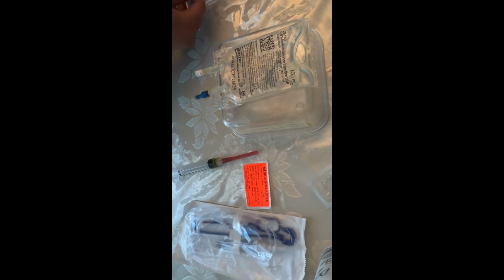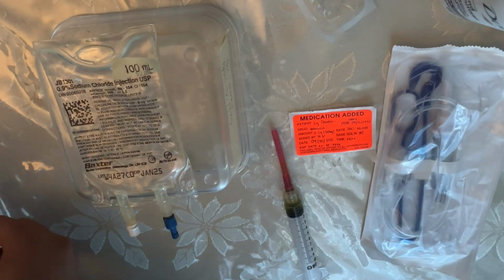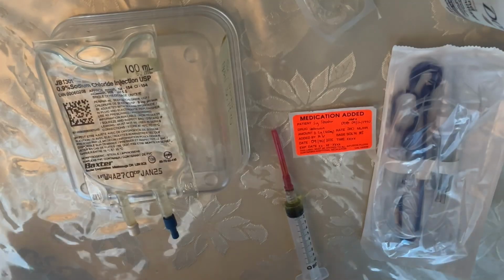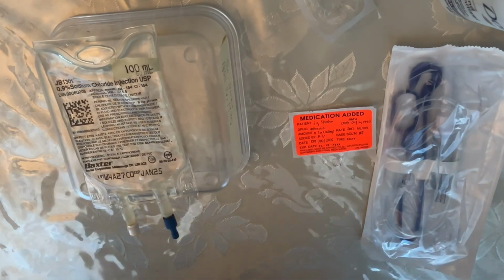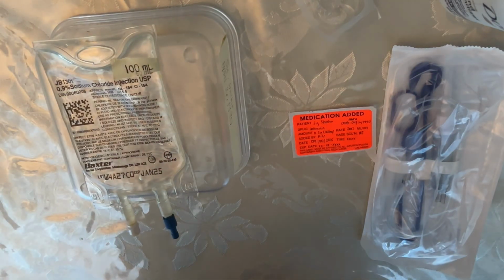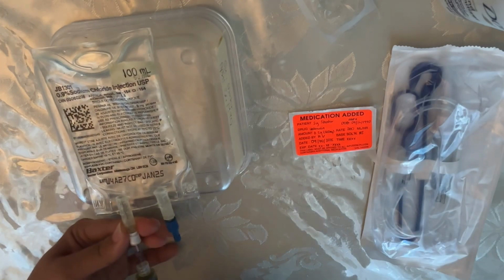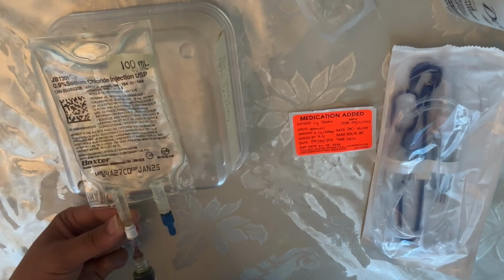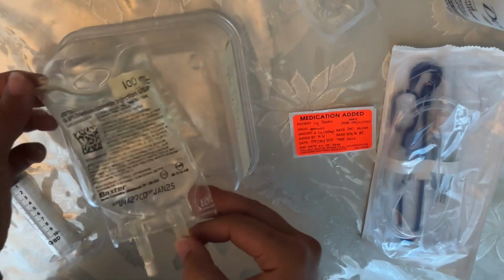Let it dry for 15. 7, 8, 9, 10, 11, 12, 13, 14. And now we're going to inject our 1 ml medication into the bag and gently mix it. Do not shake.